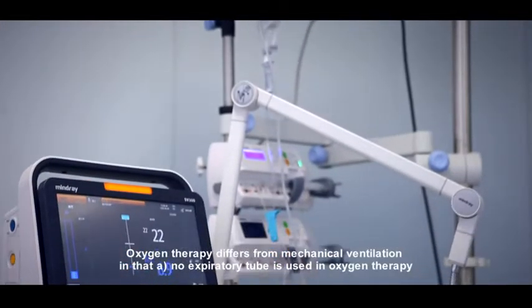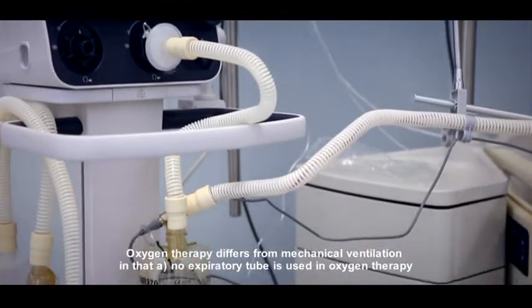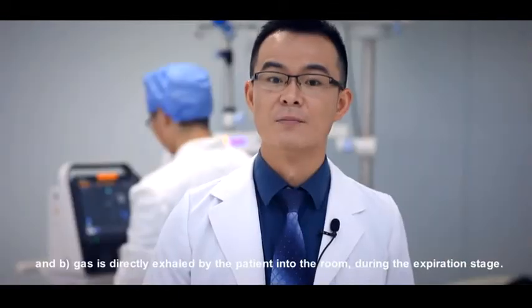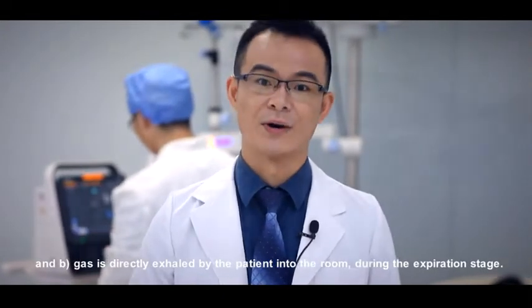Oxygen therapy differs from mechanical ventilation in that: A. No expiratory tube is used in oxygen therapy, and B. Gas is directly exhaled by the patient into the room during the expiration stage.